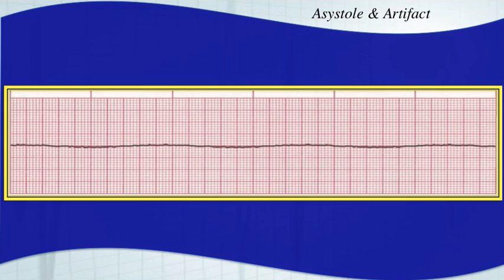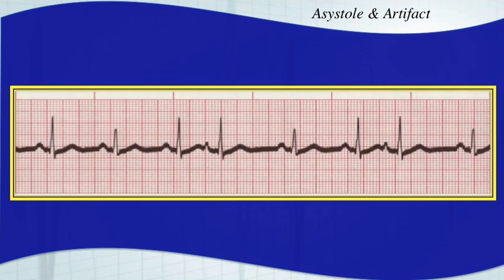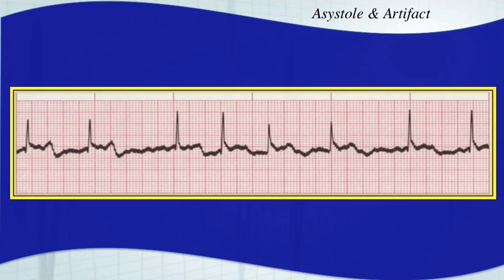Here we have an example of a different type of artifact. Looking at this, you can see it doesn't look like movement and it doesn't look like a loose electrode — that baseline looks very thick. That's 60-cycle artifact. You're going to check your electrical outlet and make sure you're not having any type of interference. Here's another example of 60-cycle artifact: that big thick baseline comes from that 60-cycle interference. You don't see 60-cycle interference as often as we used to.